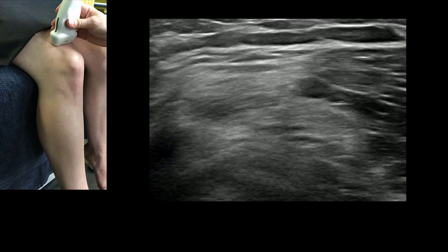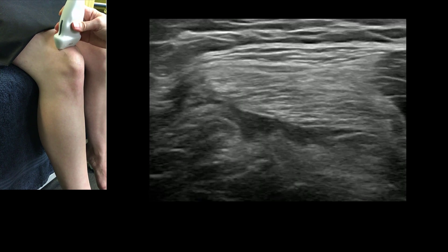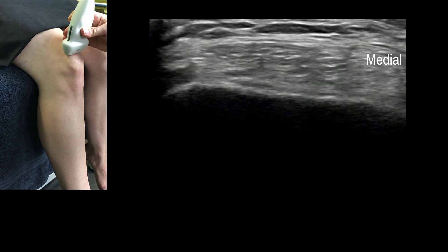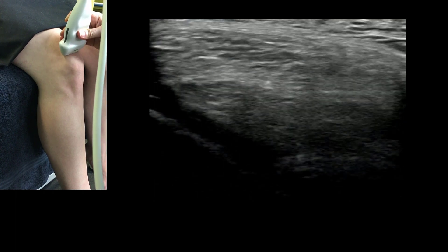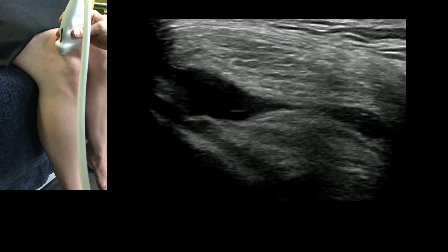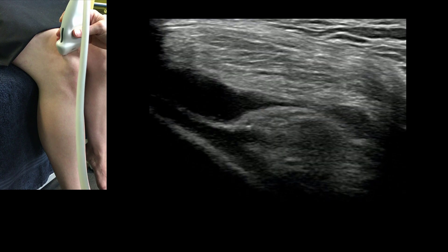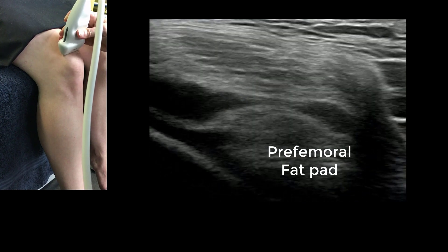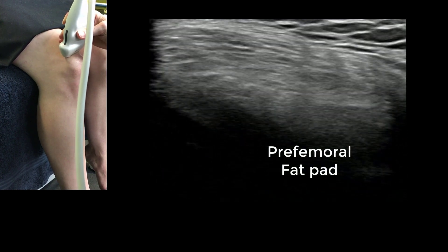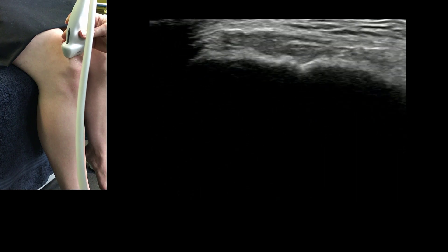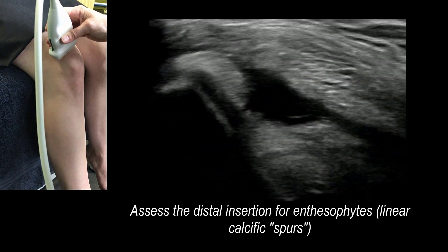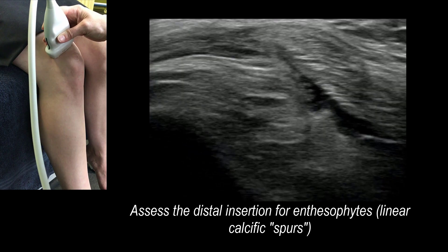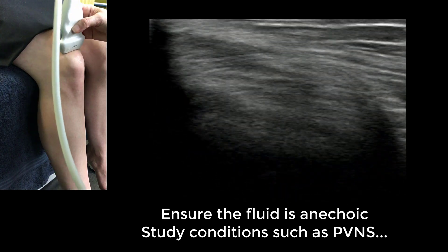We also do that in transverse — coming down on the tendon to the insertion onto the patella. Those fibers keep going, so in most series we would include maybe two longitudinal images and one transverse, looking for spurs in the tendon. Deep to the tendon we can see fluid in the knee — that's probably a normal amount of knee joint fluid.